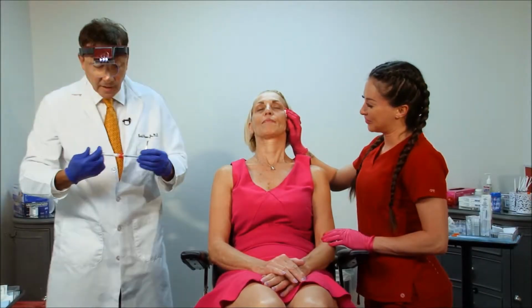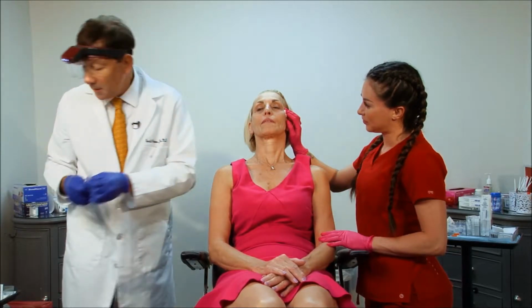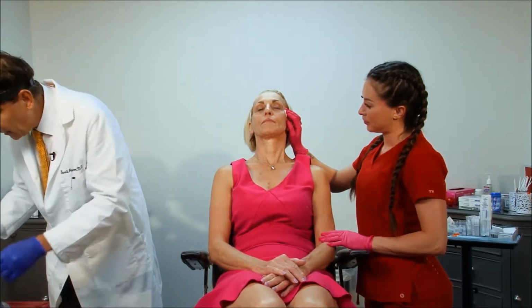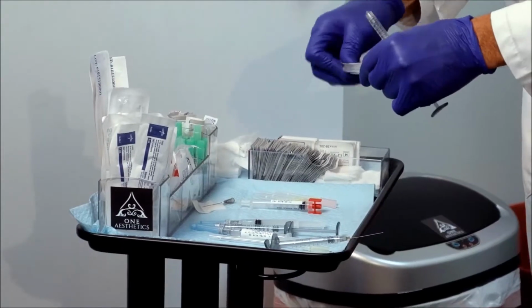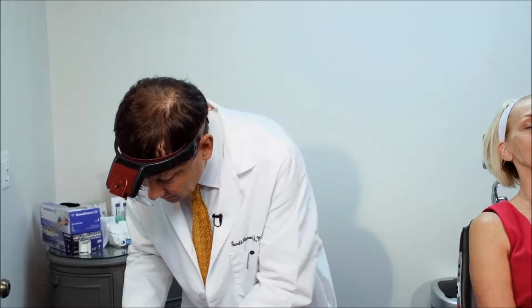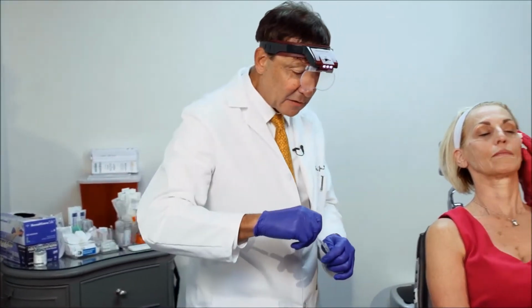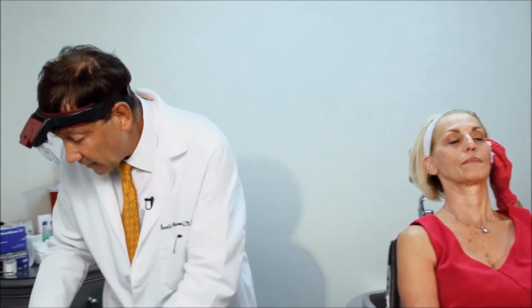And now the reason that we say open your mouth halfway is we're stabilizing the temporalis muscle. If someone clenches or talks with the needle through the temporalis muscle, that muscle moves and it can cause more trauma to the area. So by using that technique, it stabilizes the muscle. You get the needle right through it, you deliver the filler, take it out. It's just a less traumatic way of delivering filler when you're using a needle.